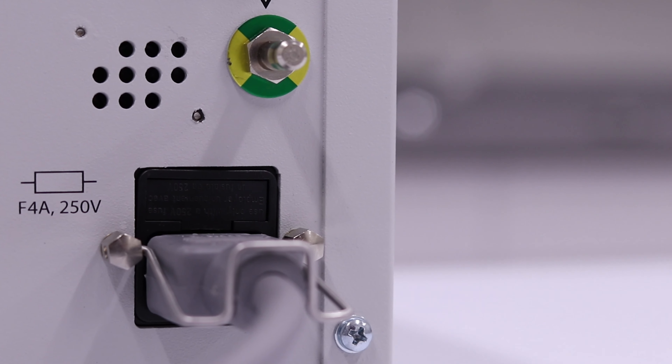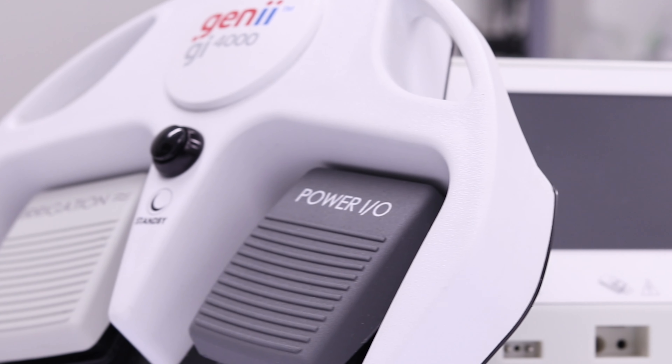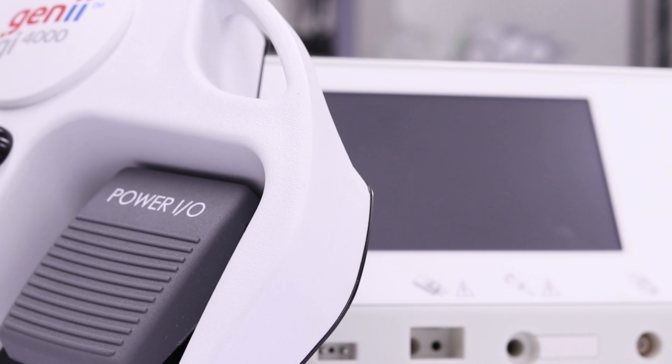Let's take a look at all the equipment we will need to perform RF output testing for the GI-4000.